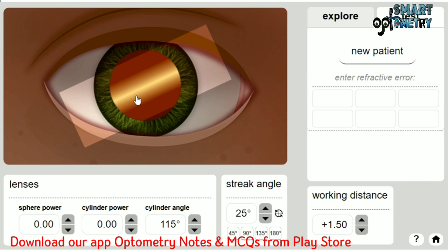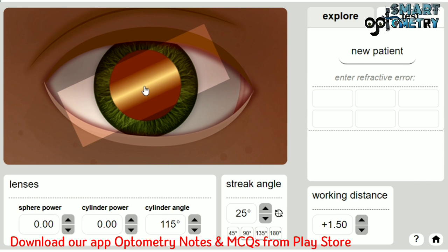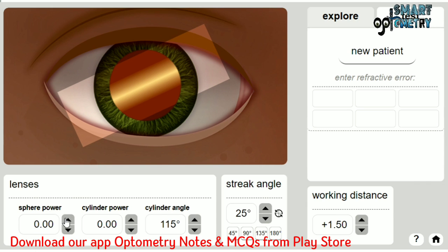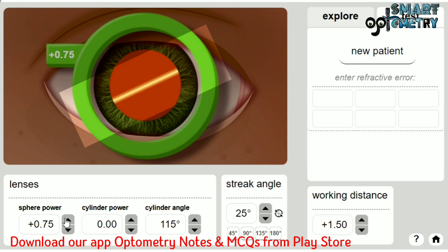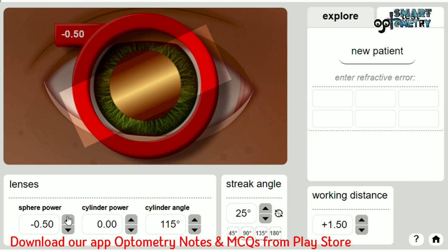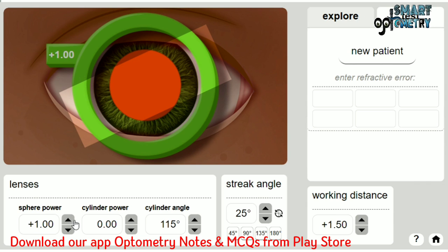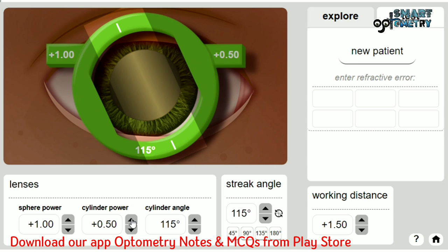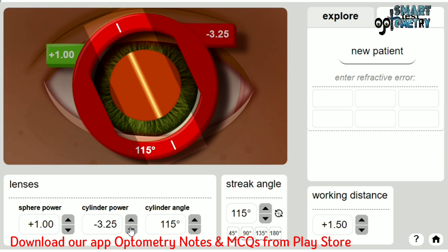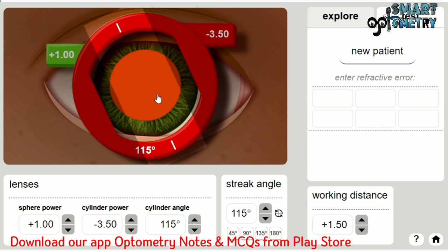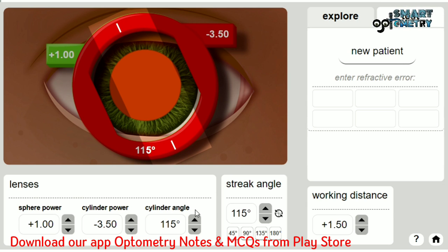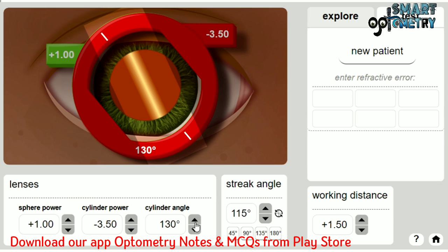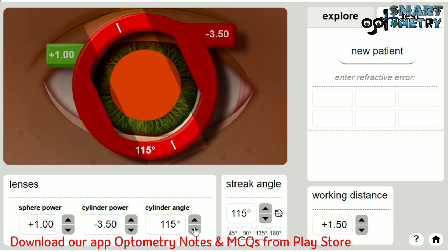After finding the principal meridian, neutralize the patient using trial lenses. Spherical trial lenses are available to neutralize one meridian — top button gives plus spherical, bottom gives minus spherical. Cylinder trial lenses are available to neutralize the other meridian — top gives plus cylinder, bottom gives minus cylinder. You can also change the axis of the cylinder trial lenses: top button increases by 5 degrees, bottom button decreases by 5 degrees.